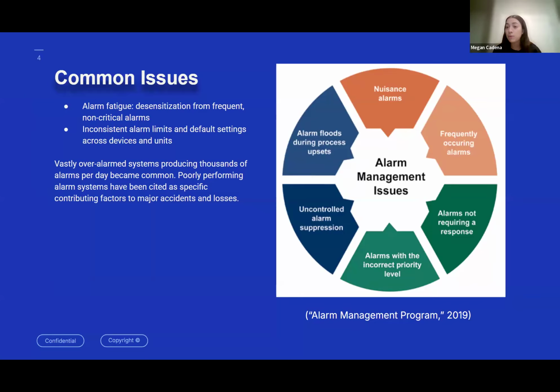In the most severe times, when critical alarms hit, if other warnings or, let's say, reminders appear at the same time, that's unnecessary bombardment instead of higher prioritization. And I would recommend an optimization to that alarm management system. Even uncontrolled alarm suppression. You want to give them options to mitigate, mute, or silence and dismiss certain alarms that aren't as crucial. So if critical alarms do arise, they can respond promptly to those and even prioritize those if, let's say, they occur at the same time.